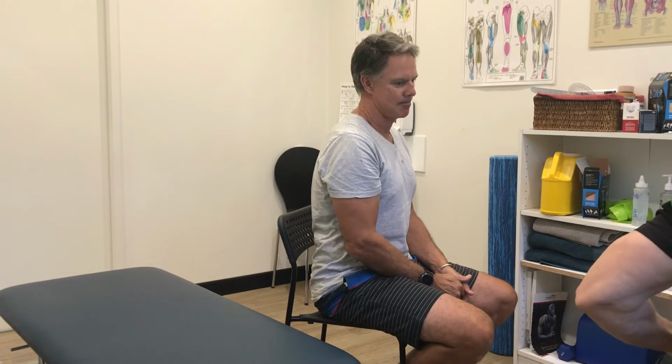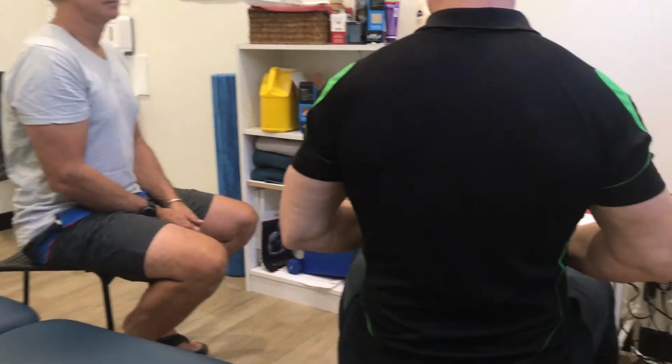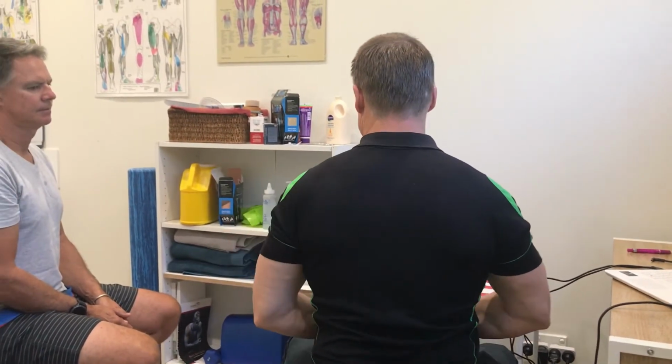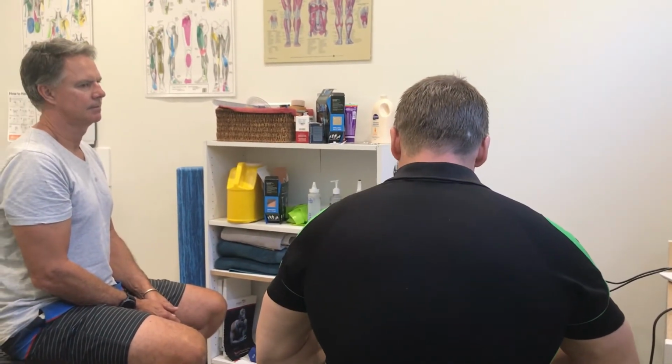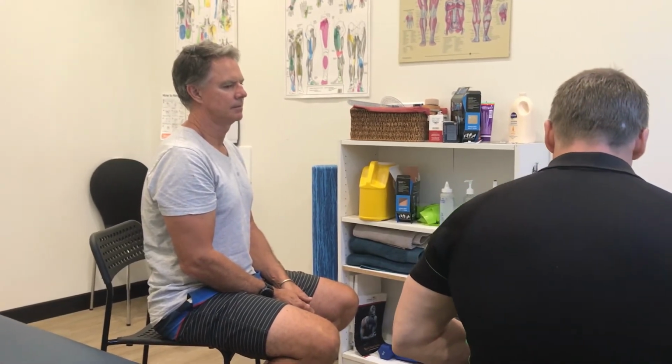Good, now you know when we were standing, we were doing that thing with the pelvis back and forwards. We're going to do the same thing in sitting, so just slide forward a fraction. This time I always think it's easier to think about your tummy, so that won't be so confusing. You can bring your tummy forward, that's going to arch your back, and your tummy back, it's going to do the opposite, and back to the middle. That's it, stomach forward, stomach back, middle.